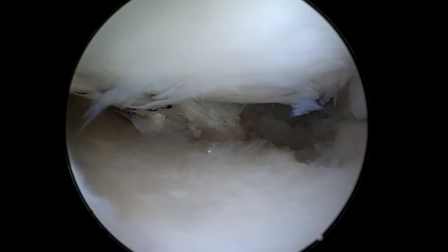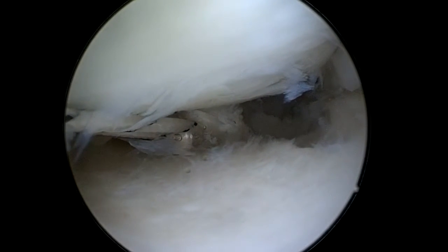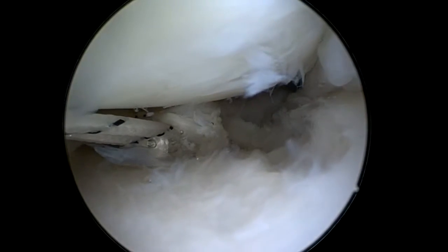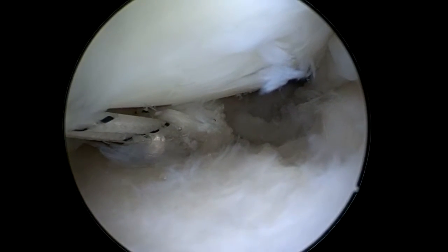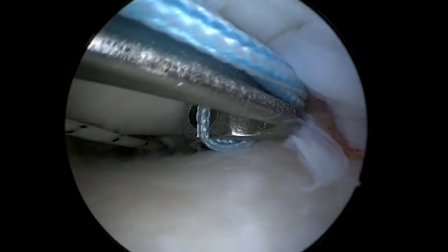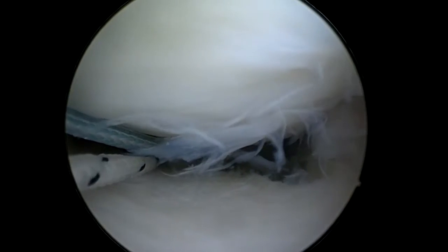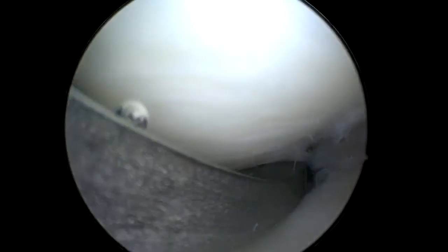A second suture is also passed through the end of the meniscus, as you can see here. This is also a loop.